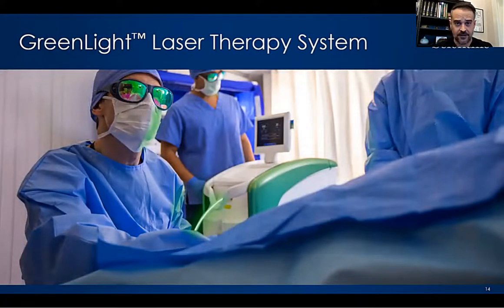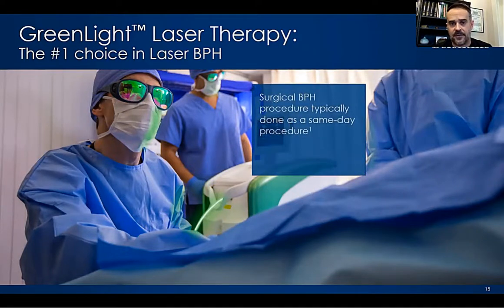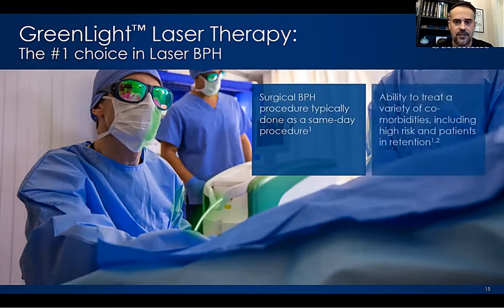Now, as we progress on from the minimally invasive therapies down to the office, out of the office for the most part, we see that we have the green light as an option for kind of the rest of the folks we're dealing with. Certainly, it's the number one choice in the U.S. for laser therapy of the prostate. It's usually a same-day procedure.